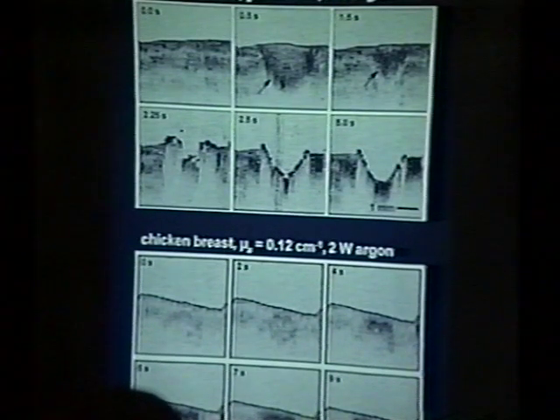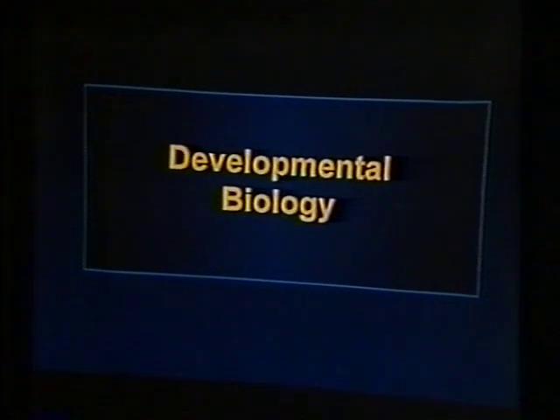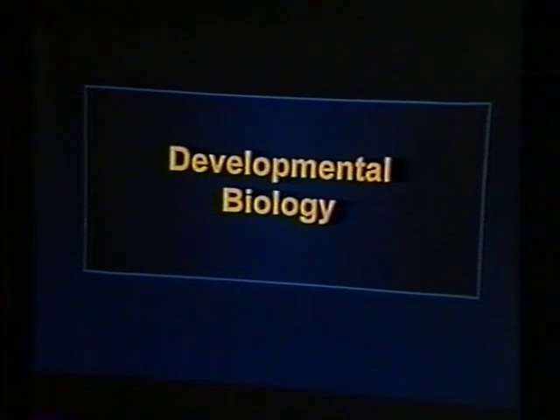So not only do you need to guide it in terms of dosimetry, but you need to actually make sure you're not floating in the middle of the bloodstream and not up against the wall. Laser ablation, people are interested in TMR, so we've looked at this laser ablation in myocardium. First, this is a static image that was done after a 3-watt laser pulse from an argon laser. You can see that the crater is defined, in addition to the area of necrosis behind it.